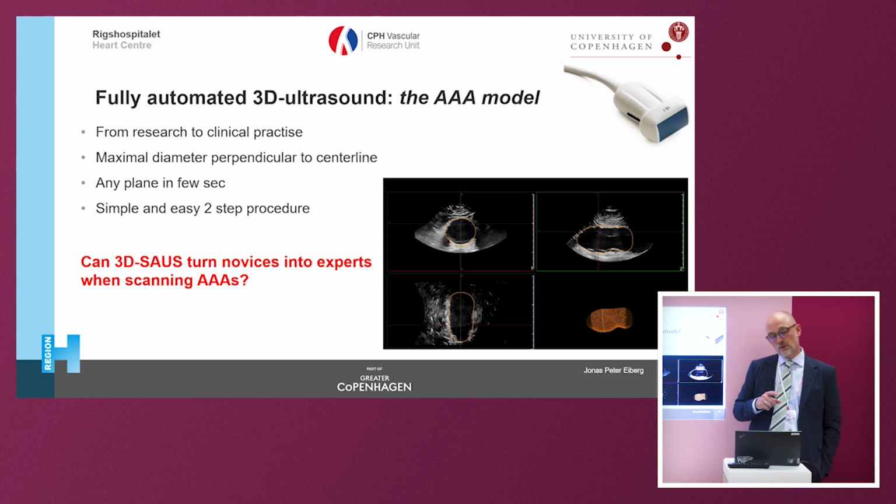I showed you before the prototype software. Now on these systems, it is fully automatic 3D ultrasound software. We call it the AAA model. And you'll get it in a few seconds when you push the buttons. We're going to play with that on the systems. We're also going to try to scan some models.